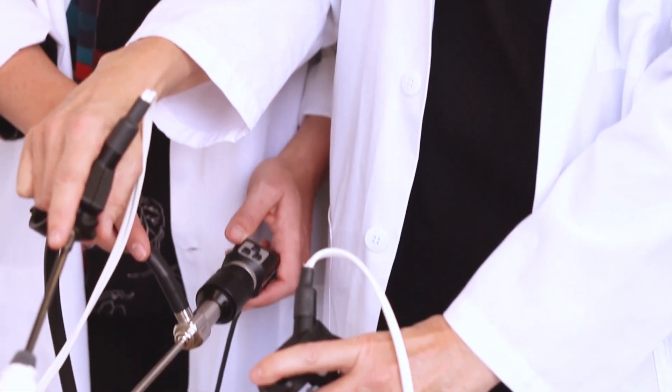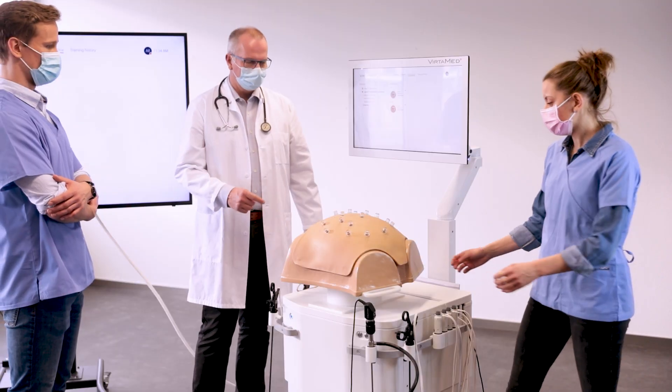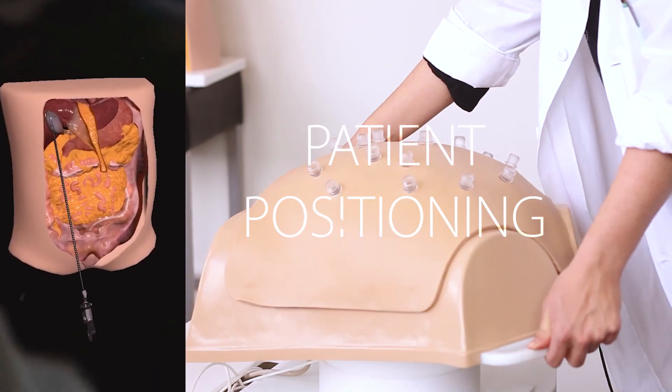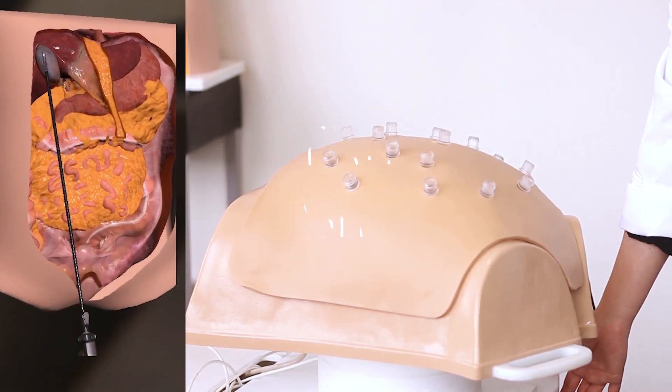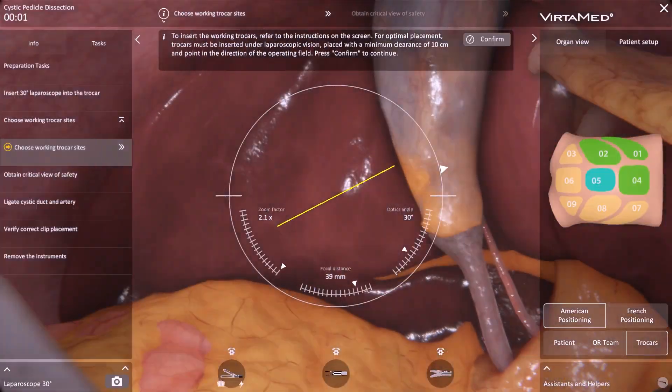But how did you get there? Did you start from the beginning? Did you place your patient in the correct position? Did you choose the right position of the trocars so that instruments are safely inserted?